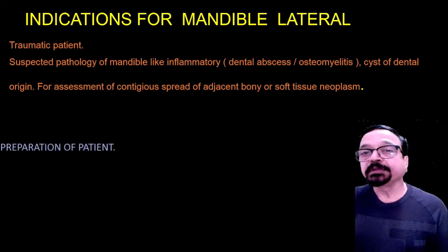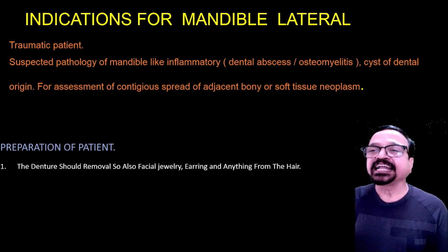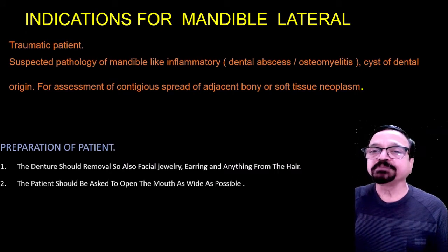Then, how to prepare the patient? Dentures should be removed, along with facial jewelry, earrings, and anything in the hair. Then the patient should be asked to open the mouth as wide as possible.